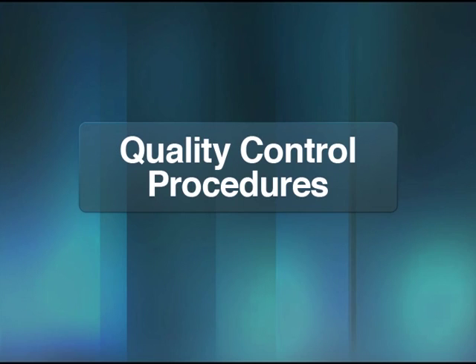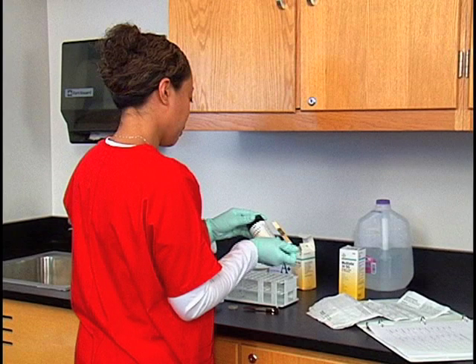To check the reliability of the Multisticks reagent strips, a quality control procedure should be performed each time a new container of test strips is opened, or when there is a question of reliability regarding the testing strips. Check sticks control strips are used to perform this procedure. The check sticks control consists of a plastic strip to which 7 synthetic ingredients are attached.